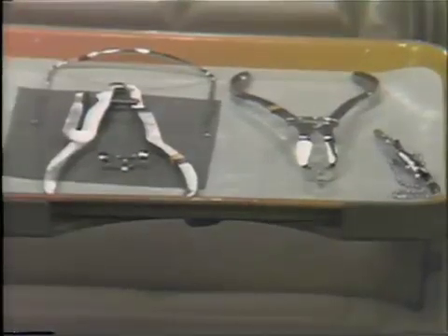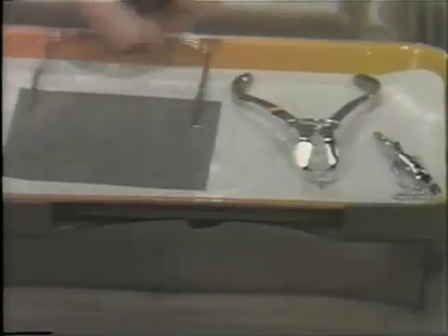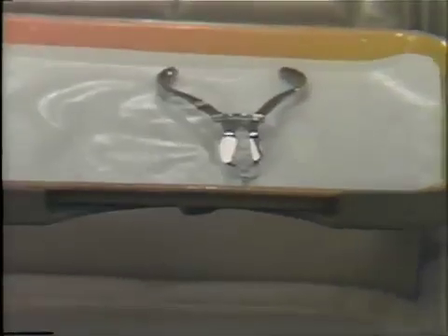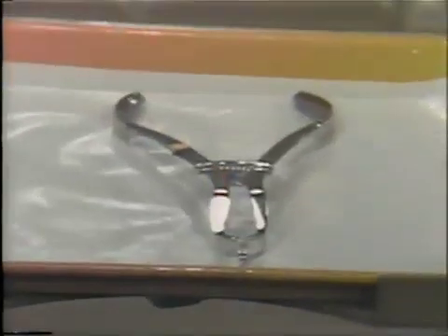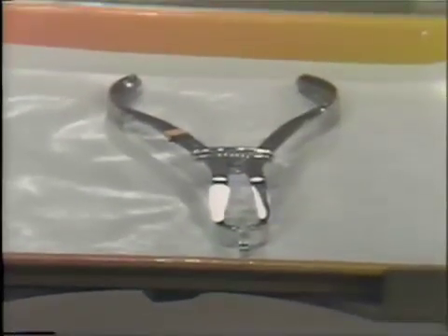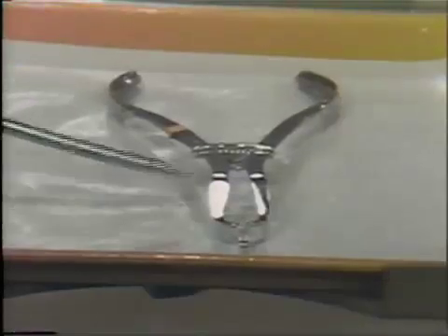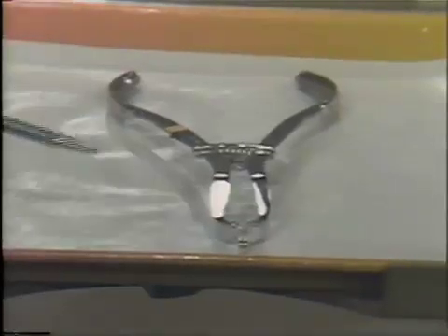After putting the patient into the chair and putting on the rubber dam, the only item that we would like to see remaining on the bracket table is the rubber dam forceps. The reason for this is that occasionally a patient may aspirate some saliva, they may have some medical problem, or you may have some problem in which you'd like to hurriedly be able to remove the rubber dam. So the only item we would like to see remaining on the bracket table is the rubber dam clamp forceps.